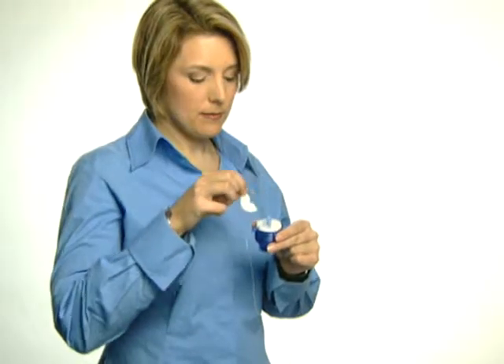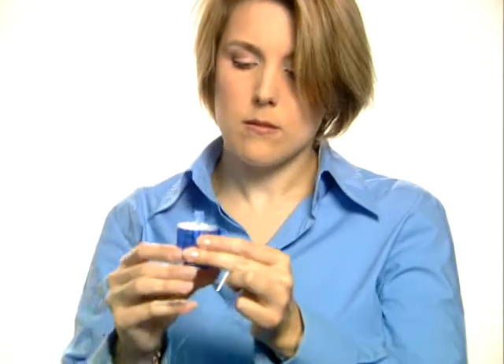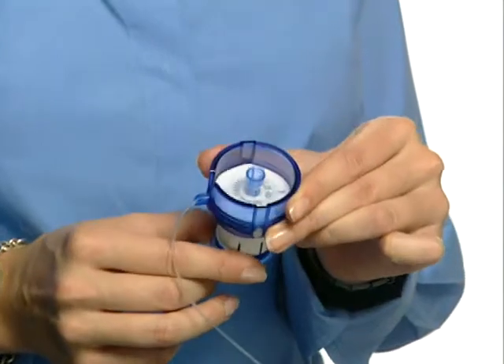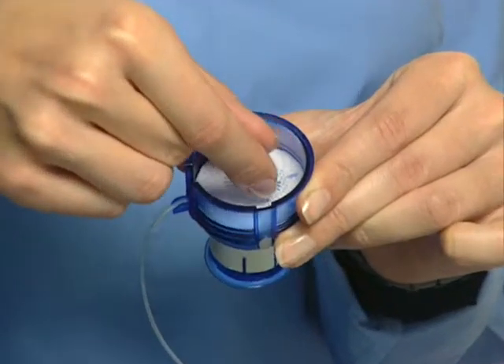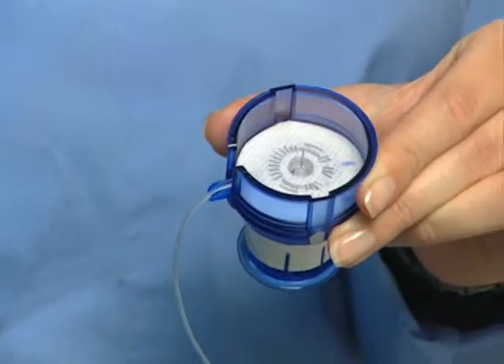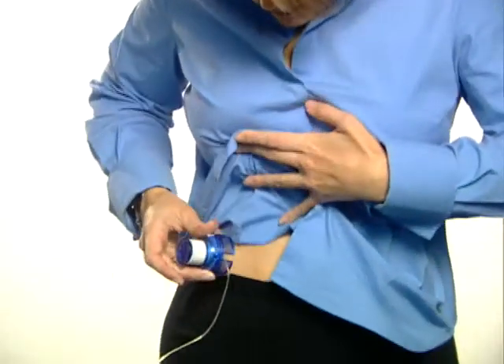Remove the paper backing from the adhesive. Pull back on the release button until the Kwikserter device clicks into place in the activated position. Safely twist off the needle guard. Position the Kwikserter device over the prepped infusion site.